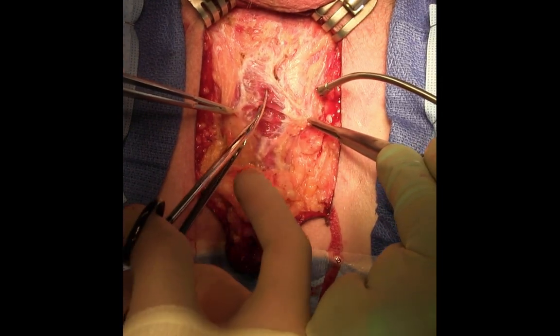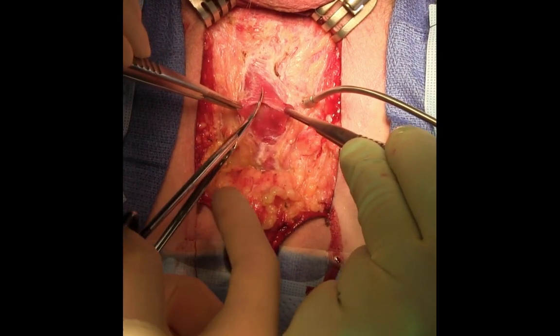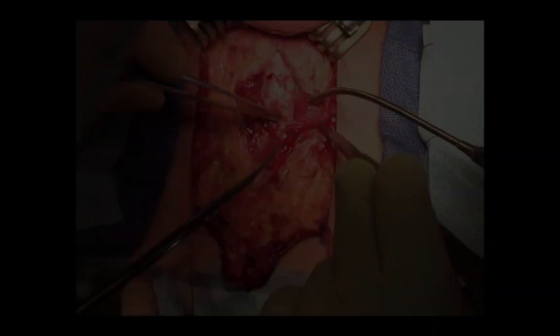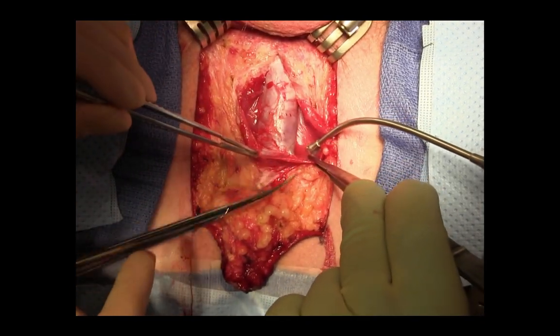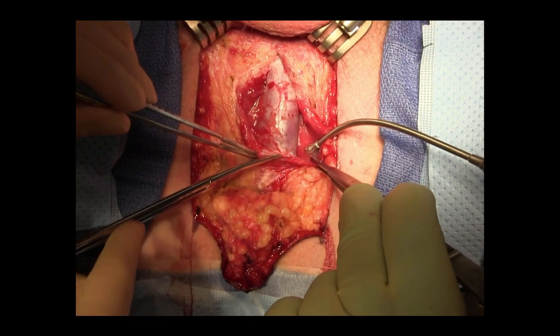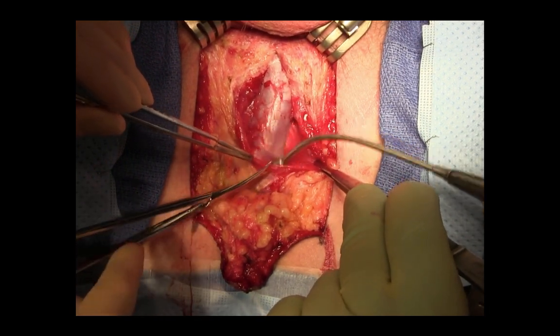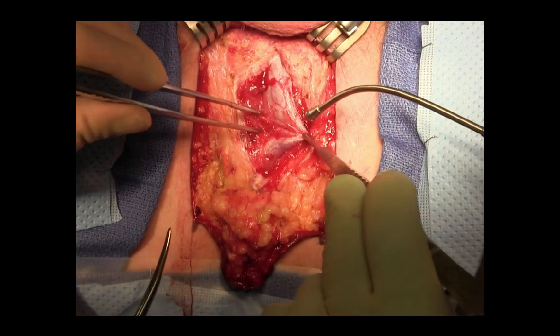Next, the bulbar urethra is exposed. We prefer to incise the bulbospongiosus muscle sharply. Once exposure of the bulbar urethra has occurred down past the central tendon and the bulb has been completely exposed, then urethrotomy will proceed.